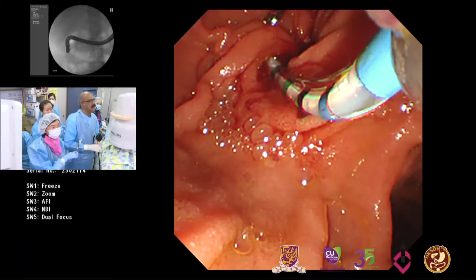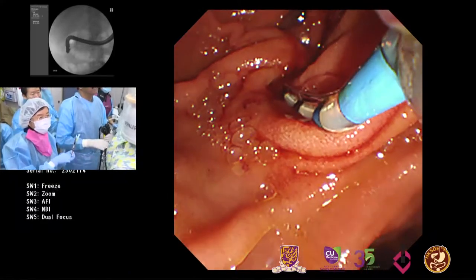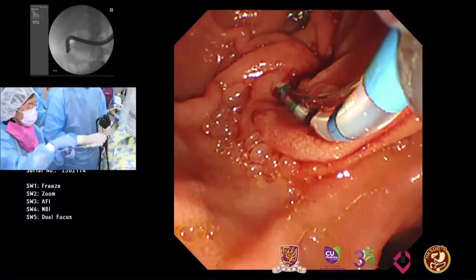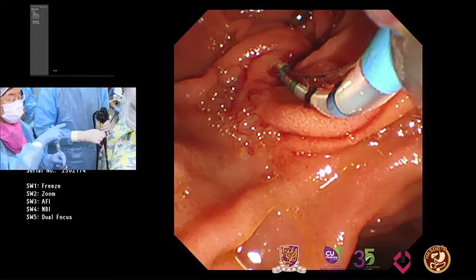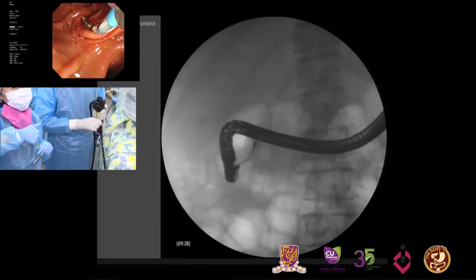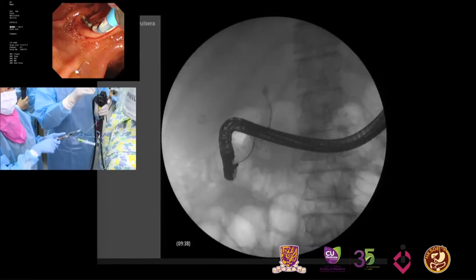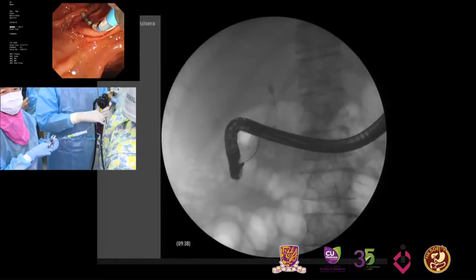No. So there's some resistance. One of the things when there's resistance, we like to inject a little to see the pathway before we go. Can you inject now, a little? We'll see where it's going now. It's going into some duct there. Yeah. So you can see the bile duct, I think, is strictured quite long.